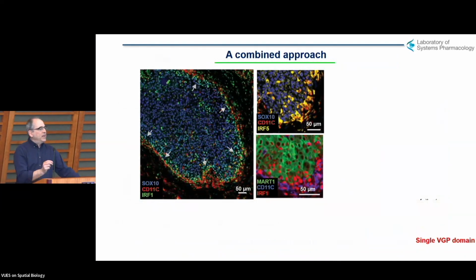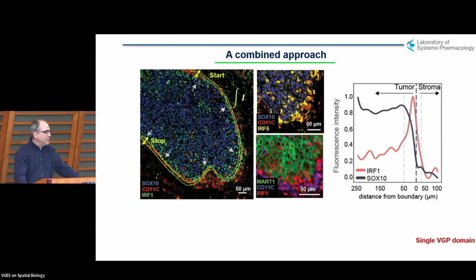And in this case, what we were trying to find was a significant environment that was associated with tumor immune interaction. And let me show you what that environment turns out to be. We found it by human annotation. We went through and drew the edge of the invasive tumor.